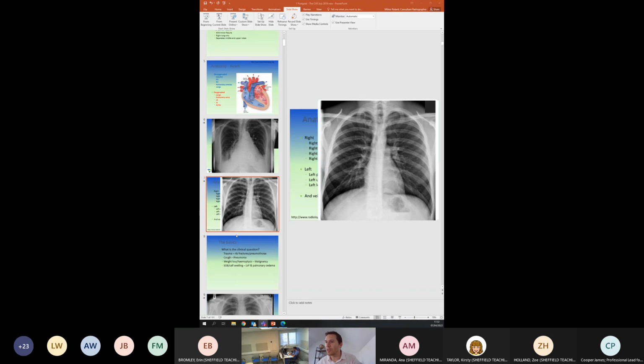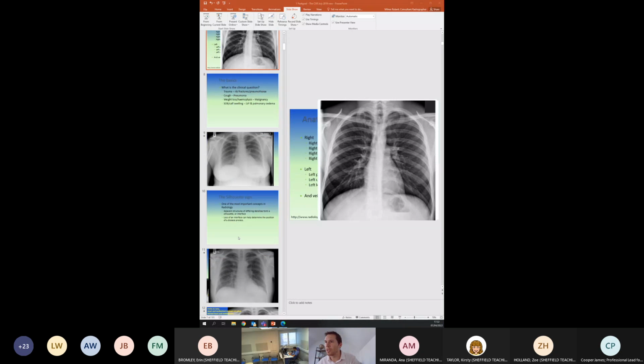Okay, so we'll talk about consolidation. Let me just see if I can share my screen again.